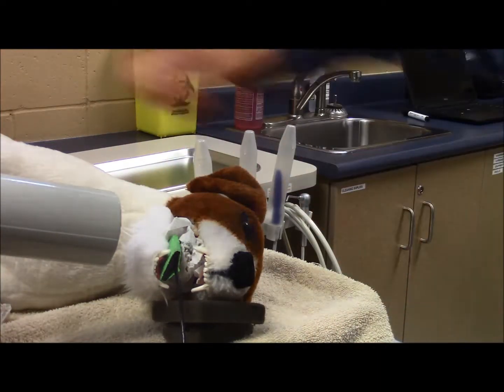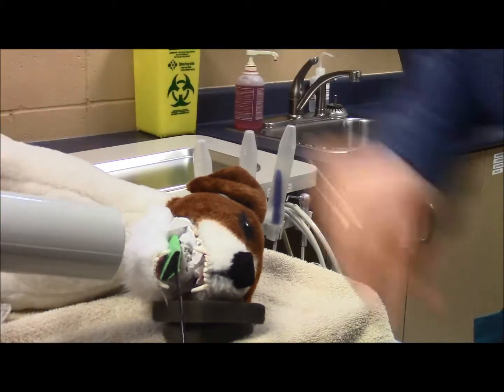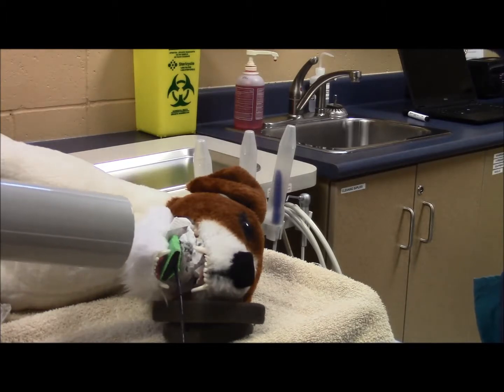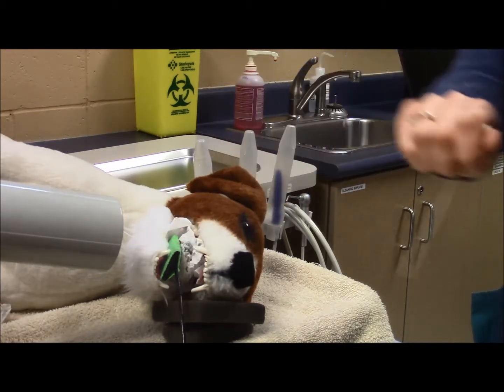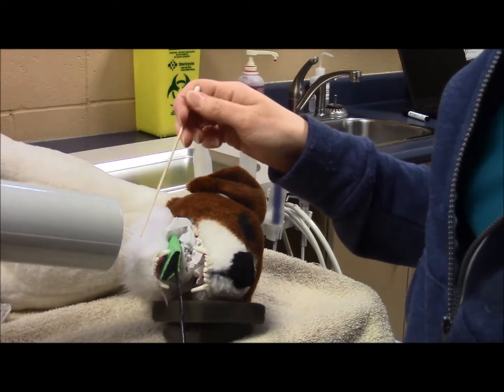Last and important thing to do is to make sure your cone is centered on your canine tooth. And again, I'm looking from here and I can see maybe it just needs to be a little bit higher, like that, so that the center of my cone is centered right on the canine tooth. When I take the x-ray, I'm likely going to have the crown and part of the root.